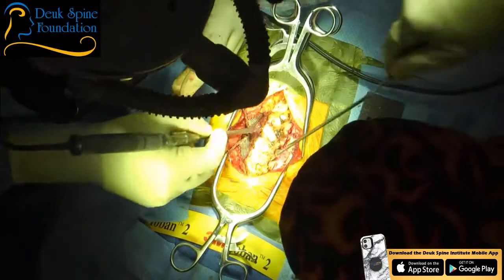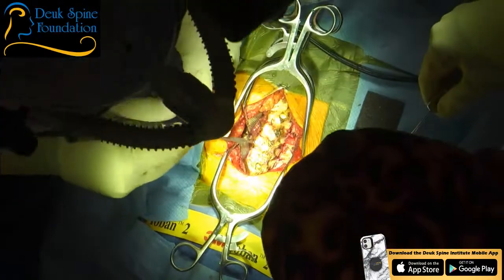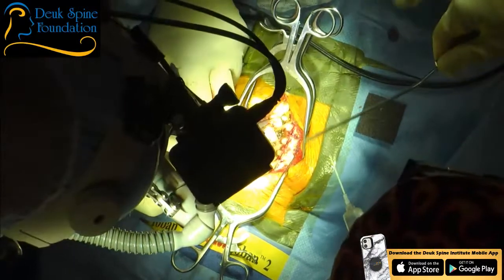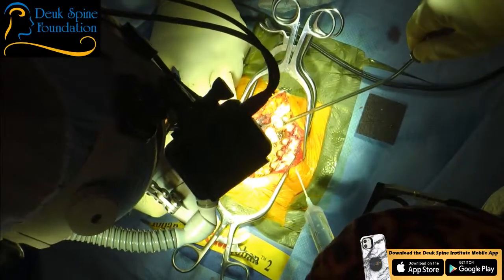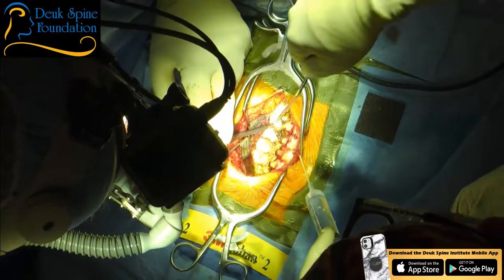All right, are you ready? So once again, 7-6-5-4-3. Are you ready? So again, you want to be conservative and err on the side of the lamina, not the lateral mass. I'm okay, Luis, thanks.